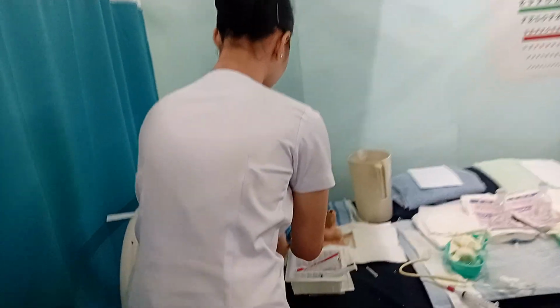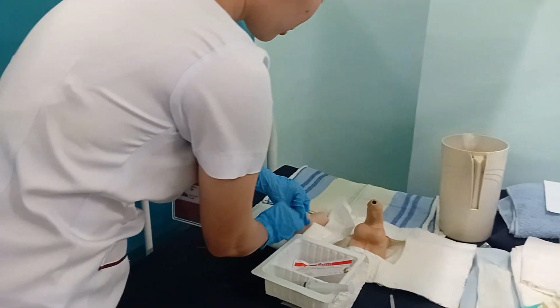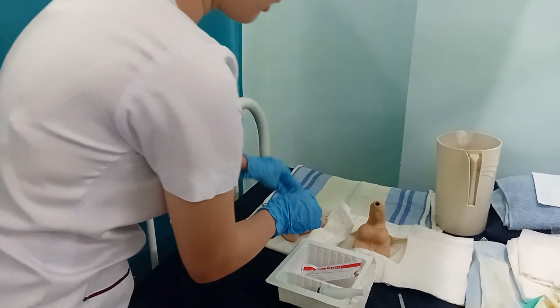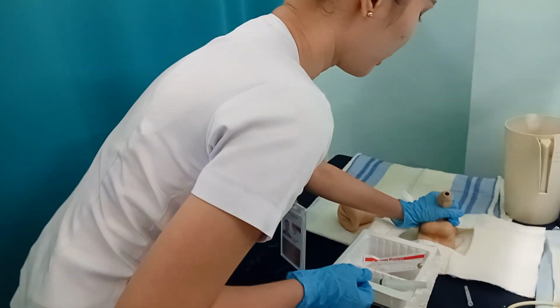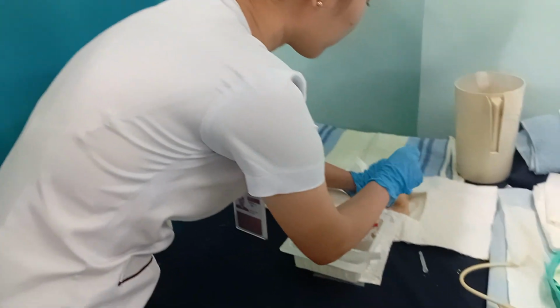Retract. And then clean with iodine. Okay, and then for the male, we are going to grasp the penis. Okay, grasp. And then we're going to clean from inner to outer. Okay, inner to outer. And what will you do after?